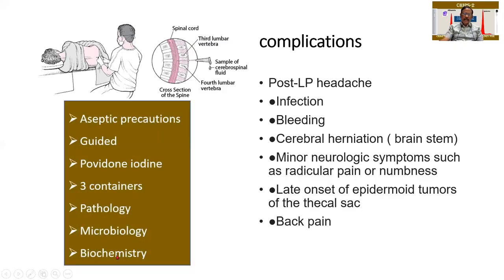So these are the list of preparation that we should be having before doing a lumbar puncture.